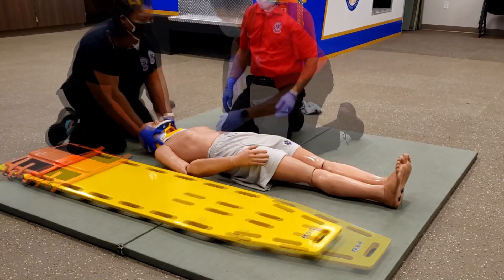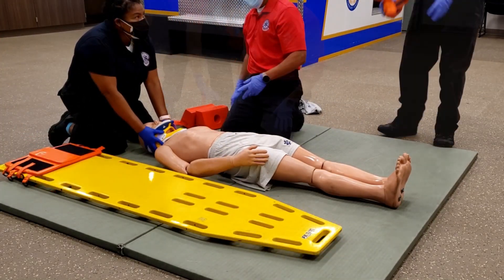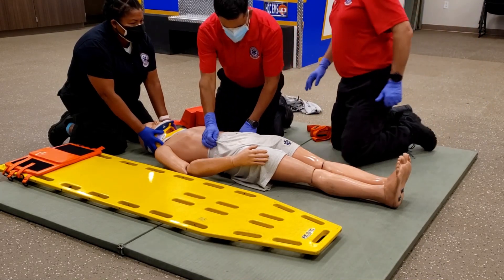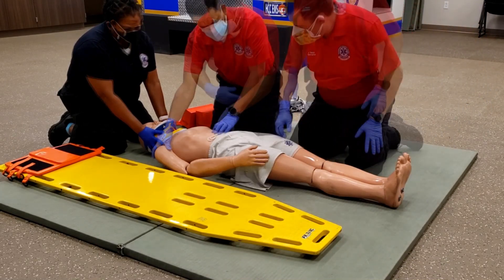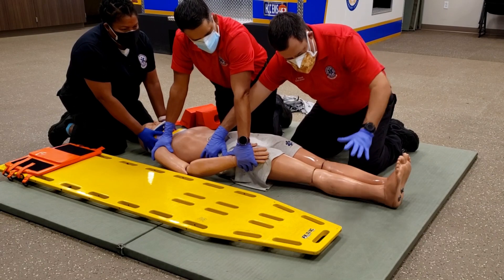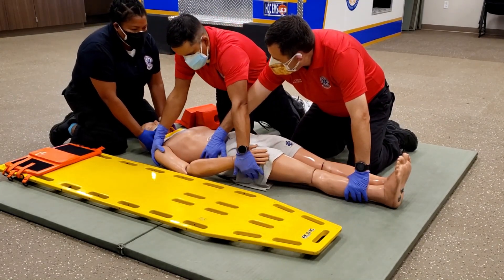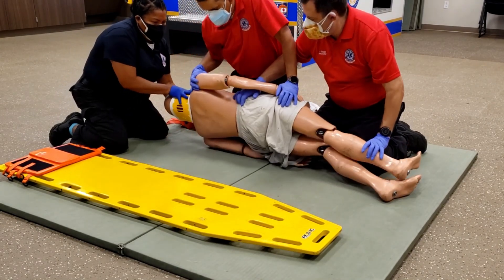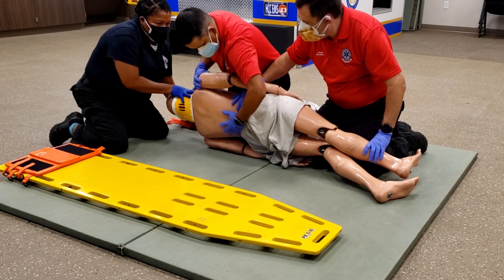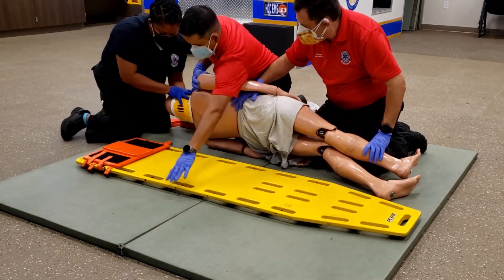Place a long spine board along the side of the patient and deploy all equipment nearby, then prepare to log roll the patient. When ready, it is up to the person holding c-spine to count so everyone can roll the patient on its side at the same time.